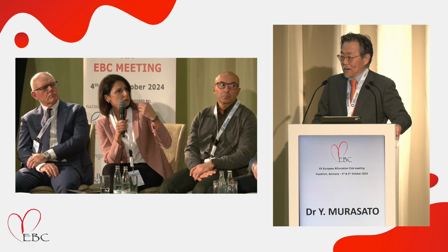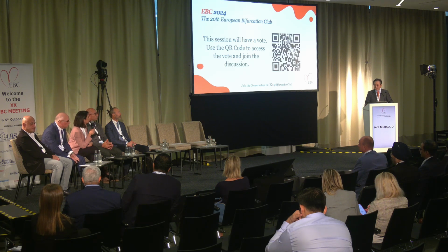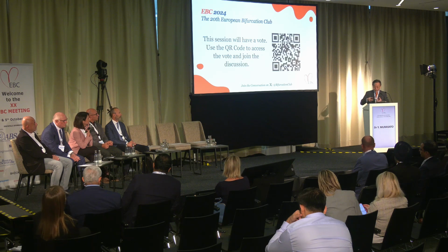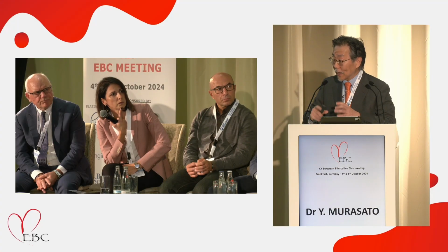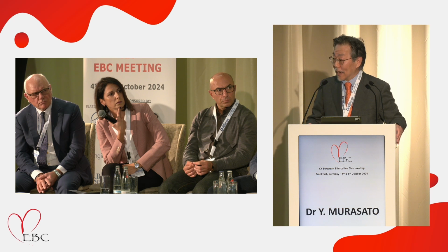How do you know, if you don't use imaging, that you did the atherectomy properly? As you can see, as I presented in the IVUS, the plaque burden is very severe, especially the LCX plaque burden, which is more than 80%.